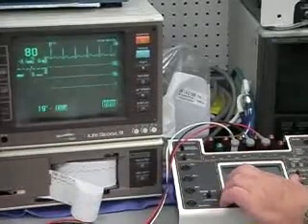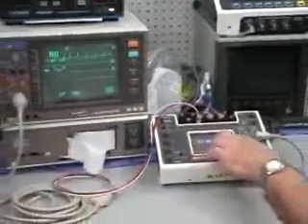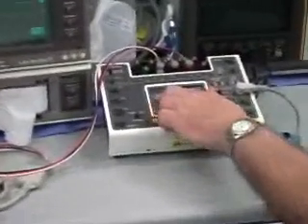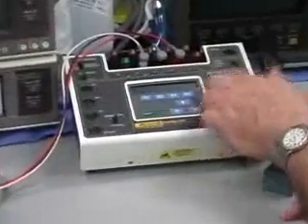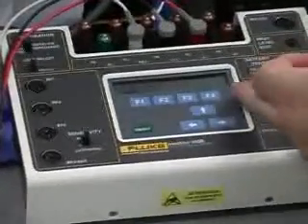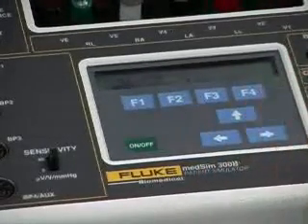So you can go in and adjust the fetal ECG, different fixed rates, or you can also do dynamic simulations where you have acceleration or deceleration of the fetal heart rate based upon the contraction rate of the uterus during labor.